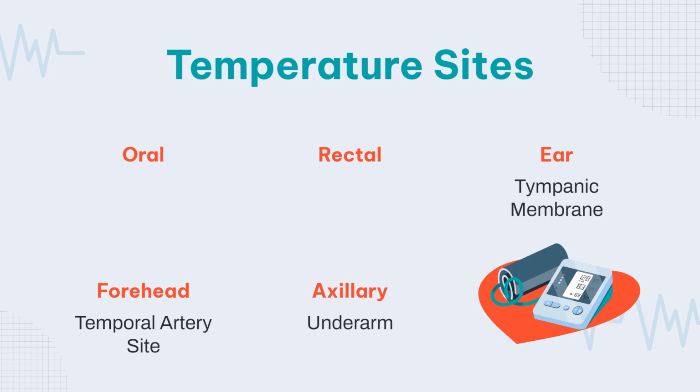The forehead is known as the temporal artery site, and an axillary temperature is taken under the arm. The axillary site is less reliable than other sites. It is used when other sites cannot be used. Do not use this site right after bathing.